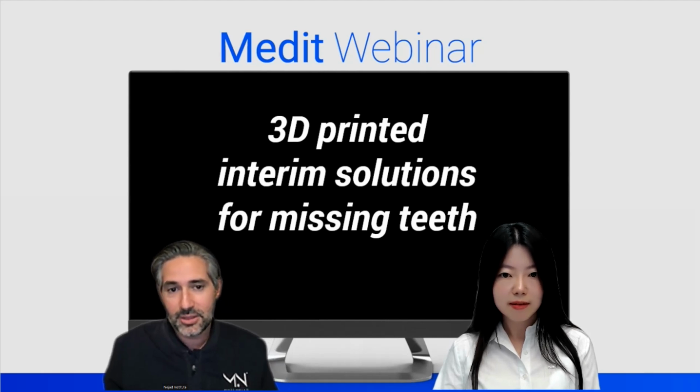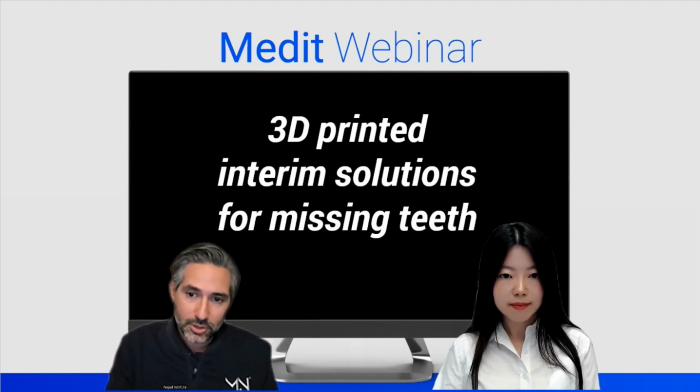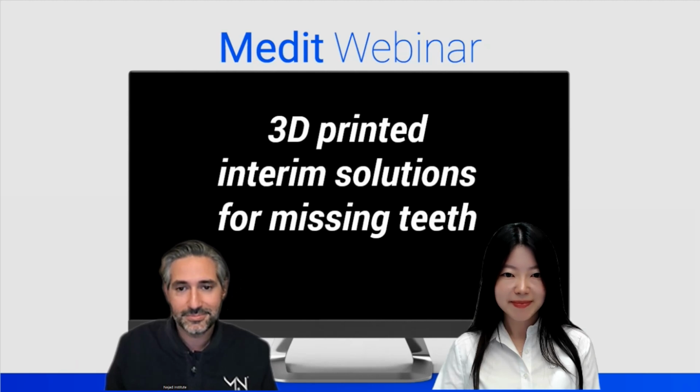So in today's webinar, I'm going to be talking about how some of these tools that Medit has in 3D printing combine to give great solutions for the implant process, including removable and fixed options for transitioning from your teeth to having an implant, the whole process. That seems really interesting. Great.